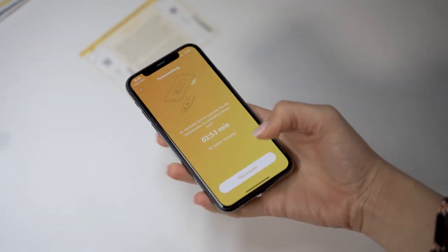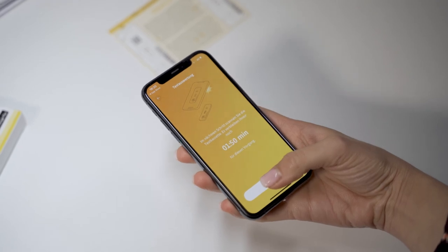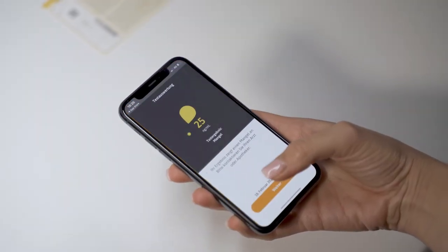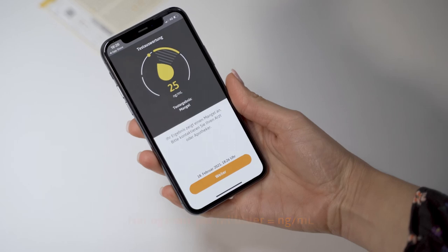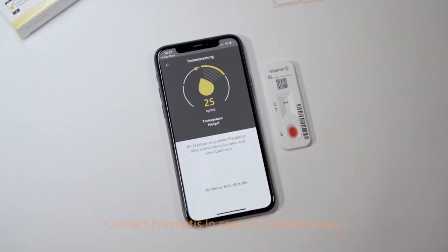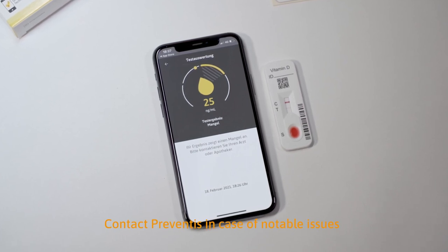Select Scan Test in the app for evaluation. The app automatically activates the flashlight of your smartphone. A template appears on your display — align this with the test cassette in front of you. Make sure to hold your smartphone parallel to the test cassette and remain in this position until the result appears on your display. The result is displayed in the app in nanograms per milliliter. If an error message appears, note down the details and take a photo of the cassette.